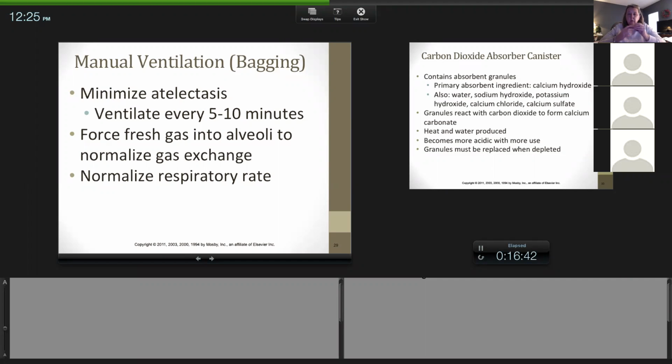And so we know the less often an animal breathes and the less deep they breathe, the less they're expanding their lungs. At minimum, we say do it maybe, I tend to do it more, I like to do it every 3 to 5 minutes. Books tell you usually every 5 to 10 minutes. But again, what value am I monitoring, or what value have you guys been monitoring, that tells you if you need to adjust ventilation?